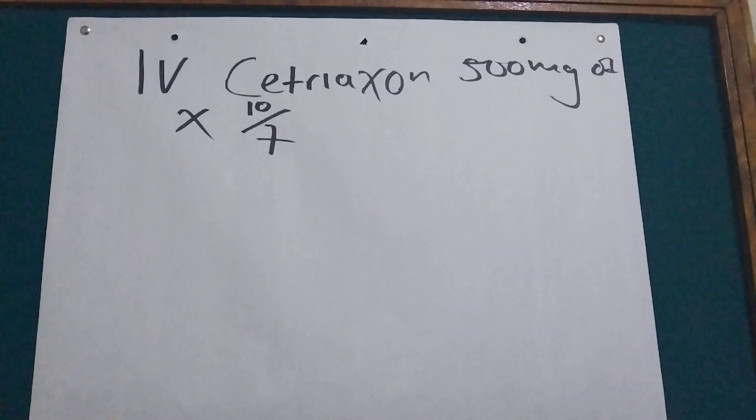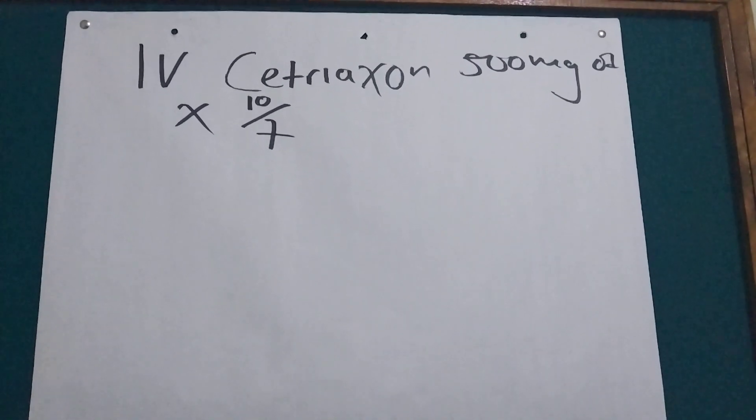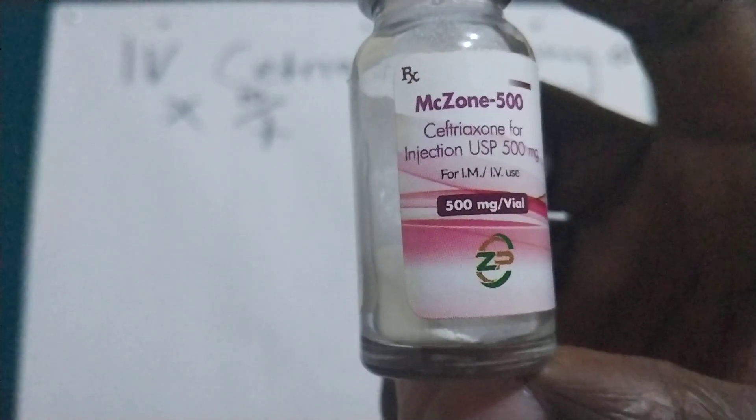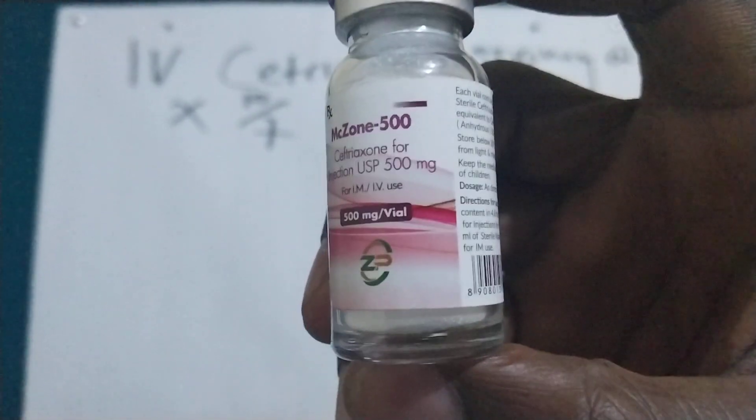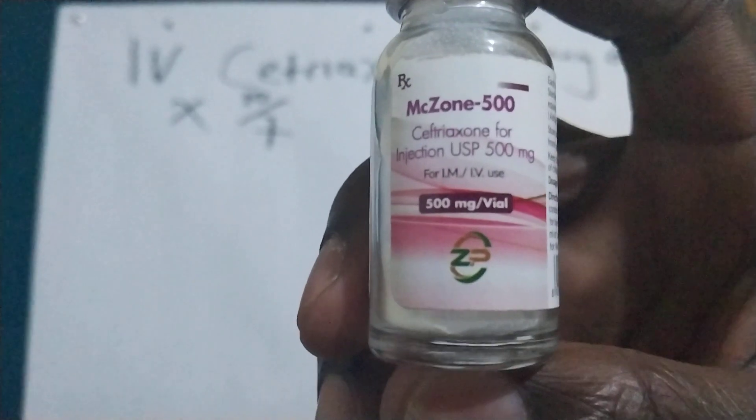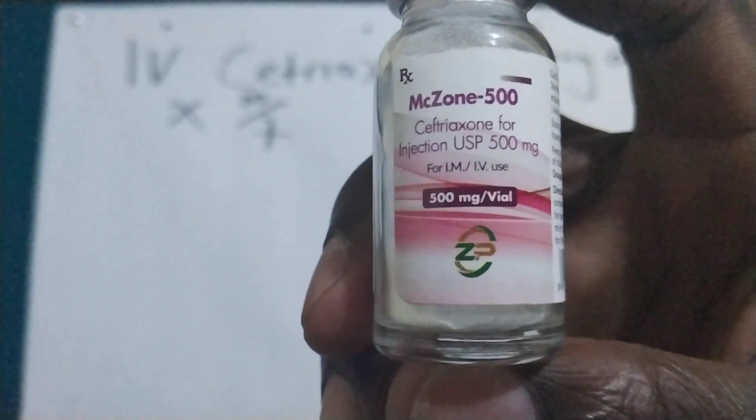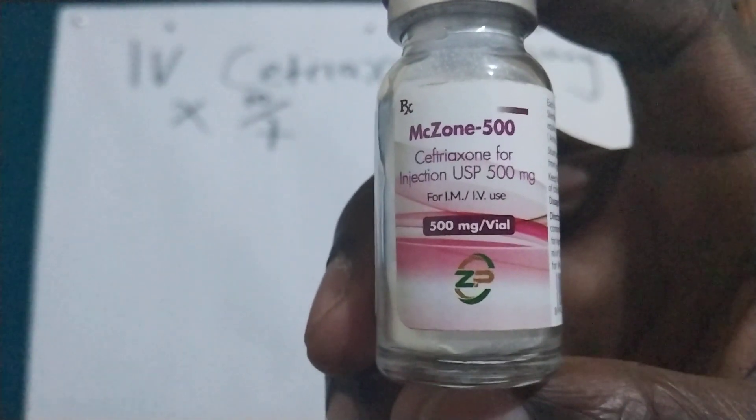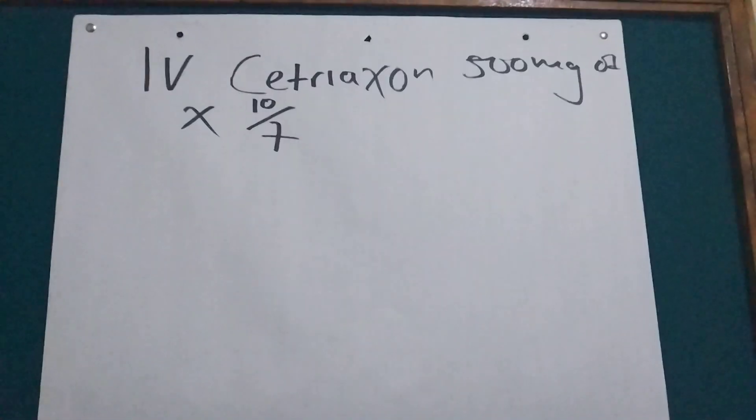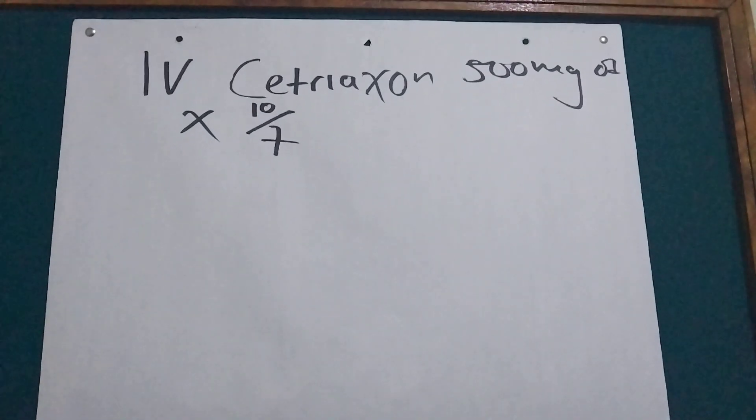So this is the vial of Ceftriaxon 500 milligram as you can see, 500 milligram per vial and you can give it IM or IV. So what we are going to do, we are first going to dilute and then we aspirate.